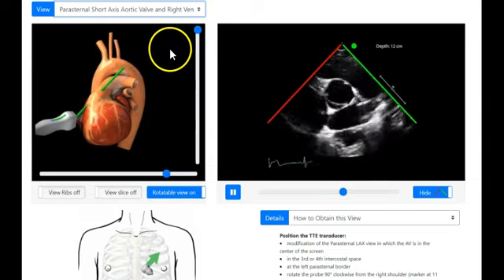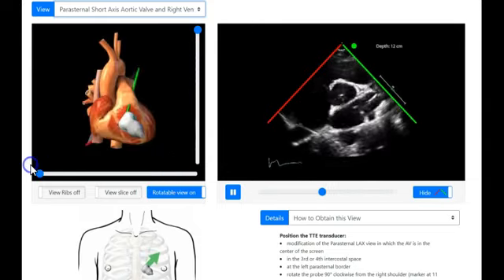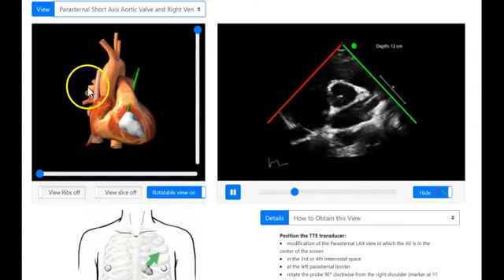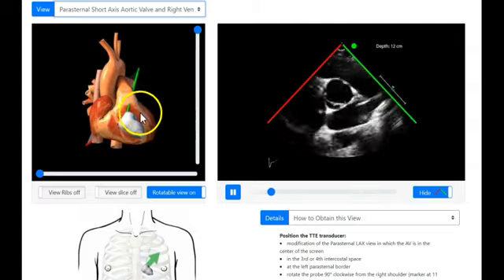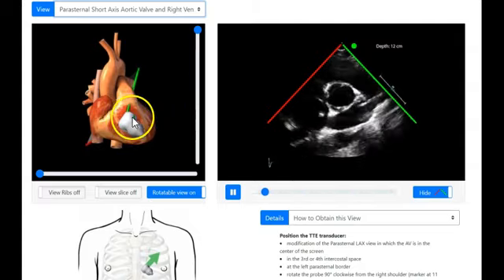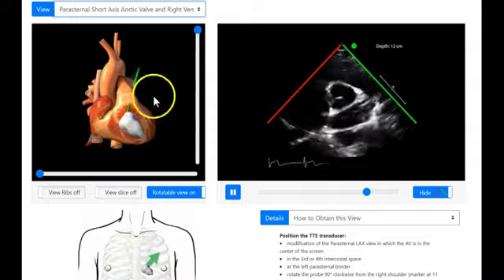And there we went on to the short axis view at the aortic valve level. Let's bring our heart orientation back to normal, and you can see that instead of our index marker pointing over to the right shoulder, we're now pointing to the left shoulder. We've turned our probe clockwise 90 degrees, and now we're going to slice through the heart like a loaf of bread, right down through it, just straight down this way here.